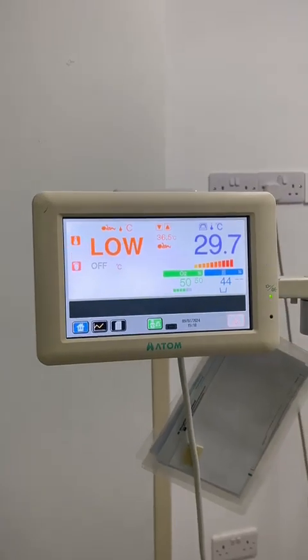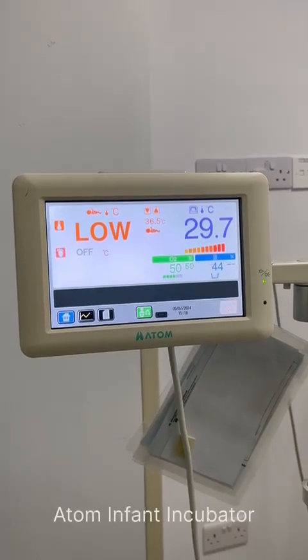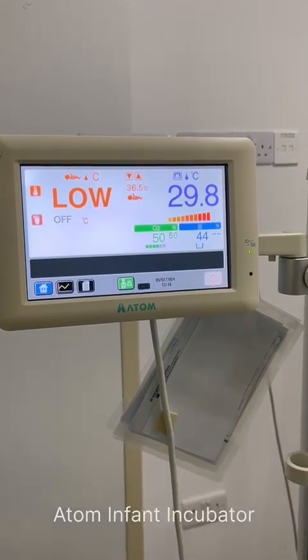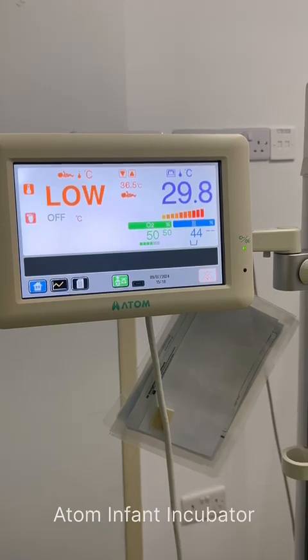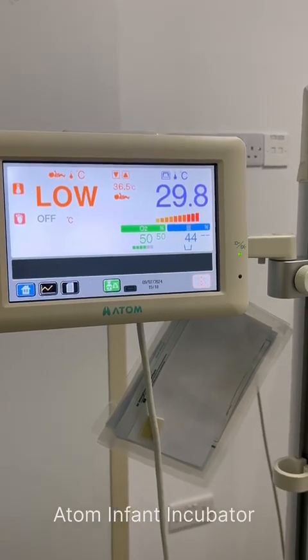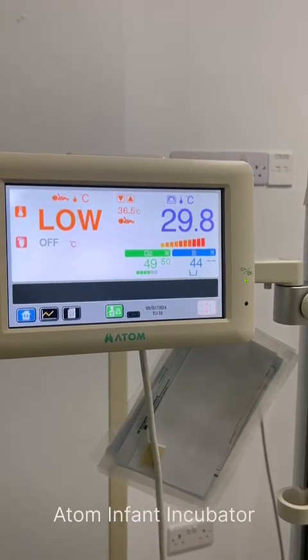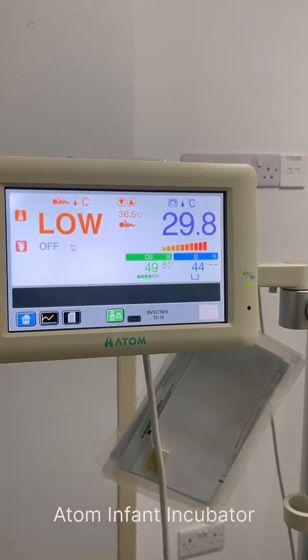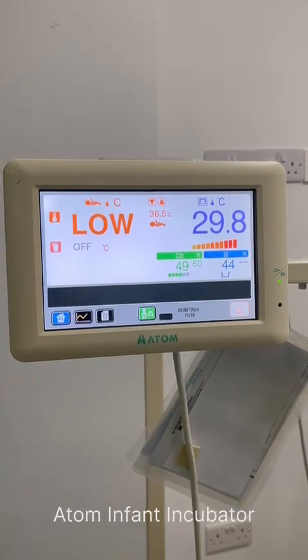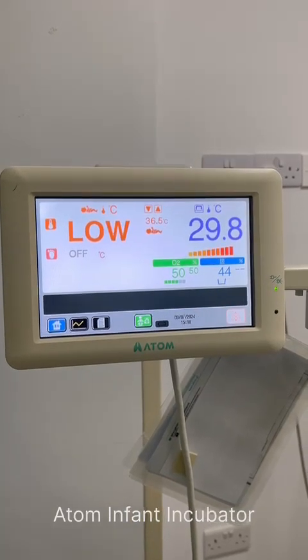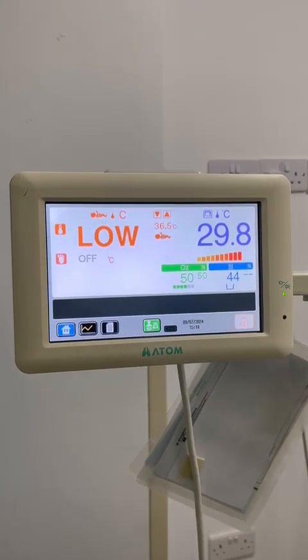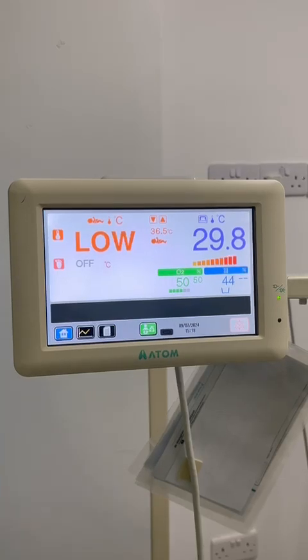The incubator simply provides us with a space where the temperature, humidity, and oxygen are regulated. This is the initial idea of the incubator and its function as well. The only question is how to control these three parameters.